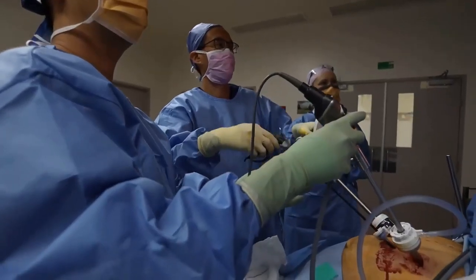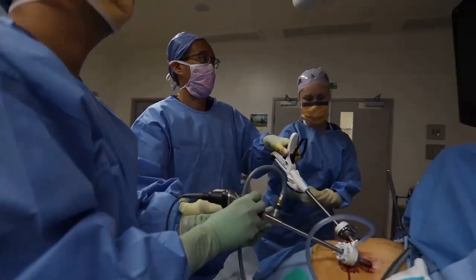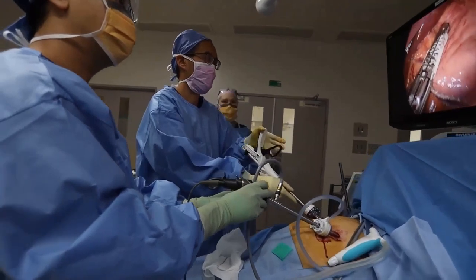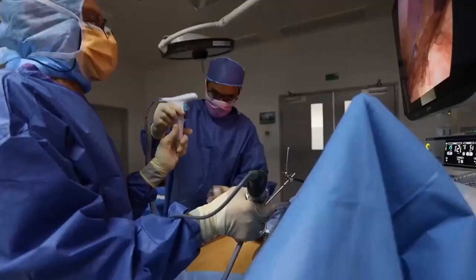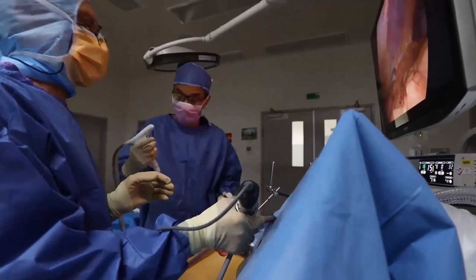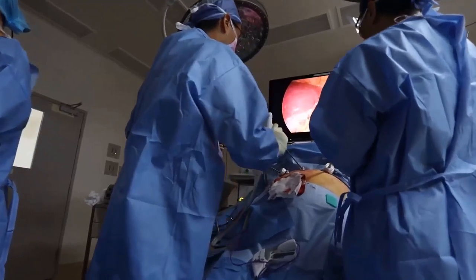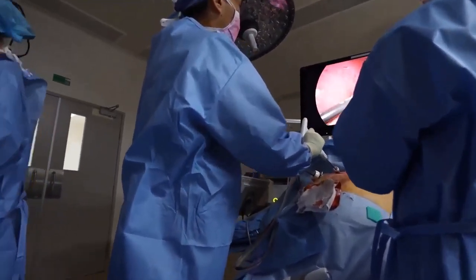Ergonomics is a very important issue in surgery. So I've found that the old reusable instruments, which are often made of heavy metal, which they had needed to be, much more heavier and clunkier. And often over time, just like any metal, they tend to sort of erode or else their function declines. Whereas with disposable instrument, I believe that there's actually cost savings, but actually you always get a clean, feels like a new car feel to them all the time, and you find it easier to use.